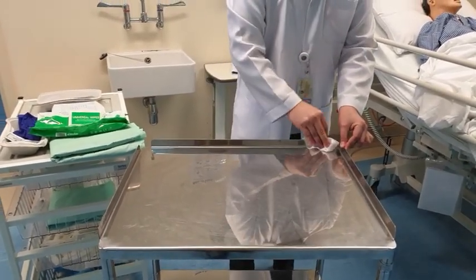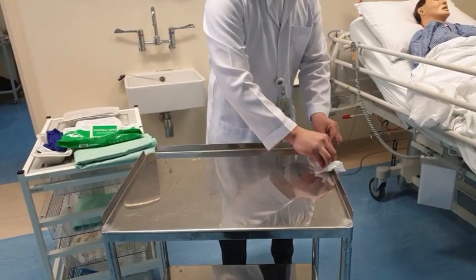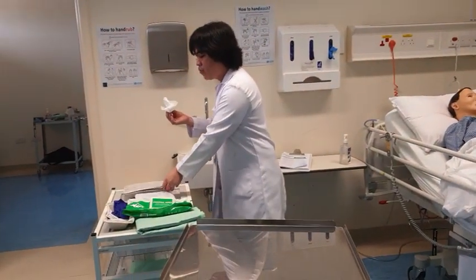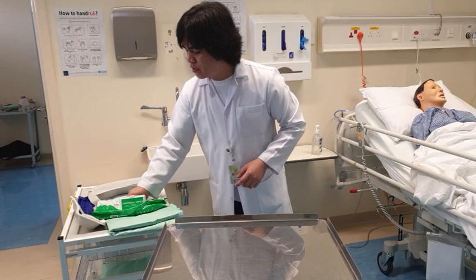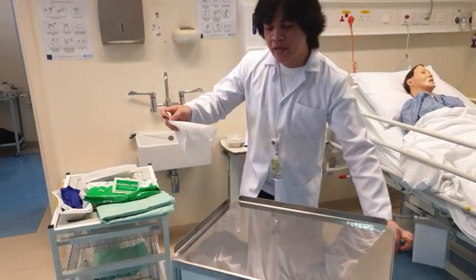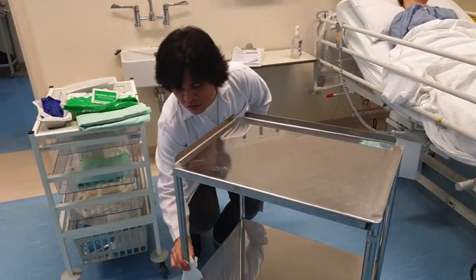Going to the side, going to the side. If you think that this is contaminated already, you can dispose this one and pick another wipe. And of course you need to clean also this side, one direction down.